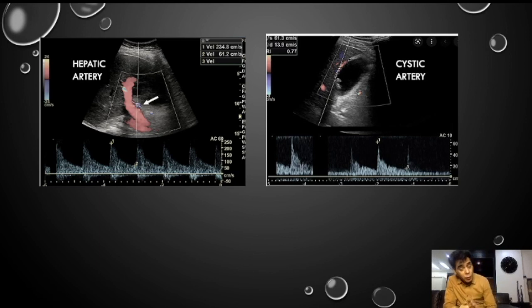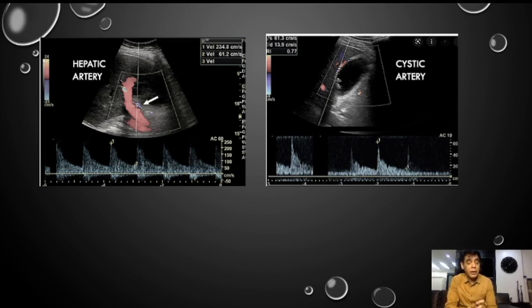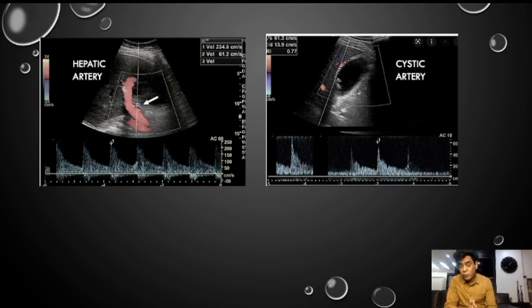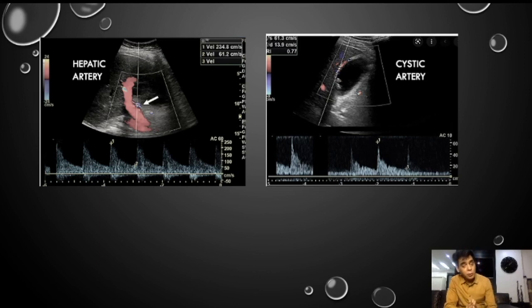When it is considered positive, it is considered positive when the absolute velocities are more than 40 centimeters per second. Remember, these two vessels can help you in dubious cases when there is a doubt in differentiation between acute and chronic cholecystitis. So that's all. Thank you.